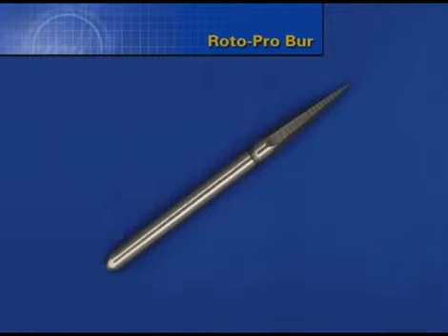Rotosonics is an excellent initial choice to impart energy to loosen and remove some post. The 6-sided, regular tip RotoPro burr simply inserts into any friction grip handpiece. When the instrument is rotated at 200,000 RPMs, its 6 edges produce 1.2 million vibrations per minute.